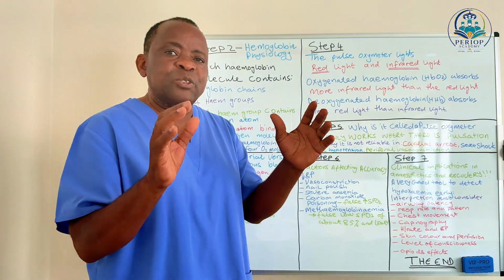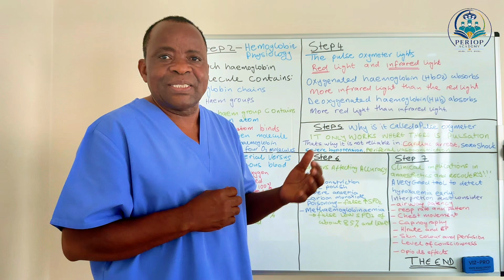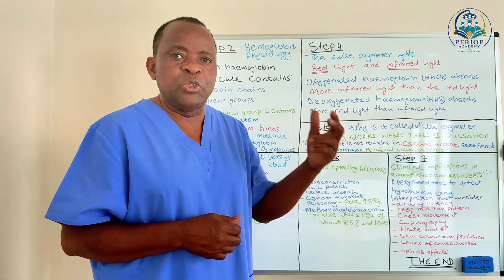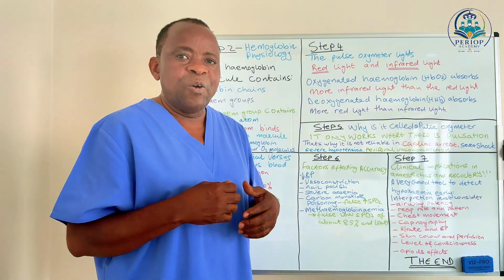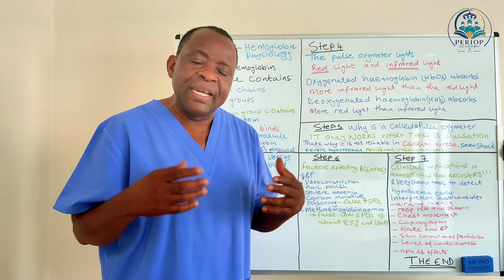When the patient comes to recovery, usually if they have an airway adjunct like an LMA, not an ET tube, unless they're going to ITU or HDU for further ventilation, normally when they come to recovery they would have an LMA.